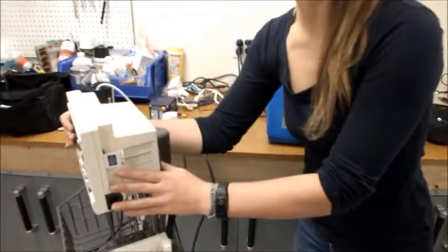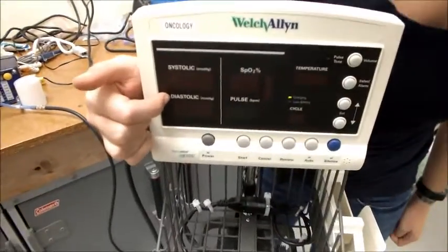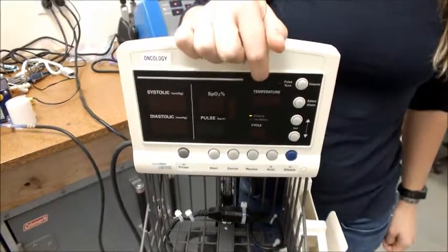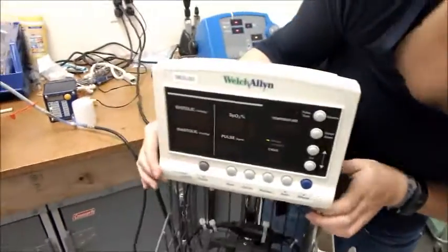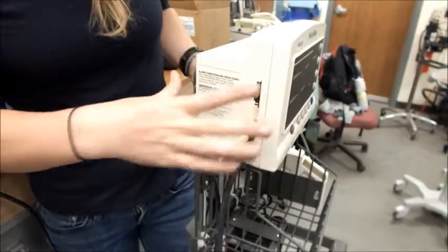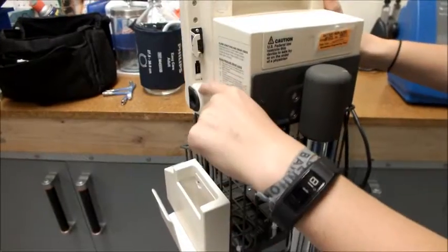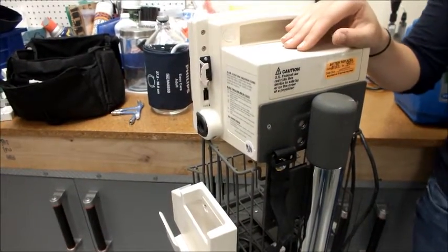On this machine over here, you can see we also take the blood pressure and the SpO2, but on top of that we'll be taking temperature. So if we turn the machine around, we already have our blood pressure cord attached right here. But if we turn the machine around, you'll notice we're going to need a temperature attachment and an SpO2 attachment before we can test our device.